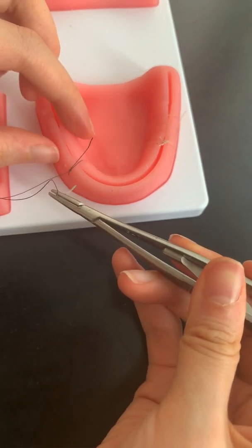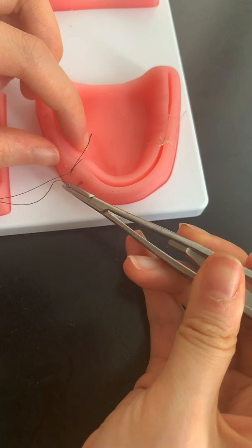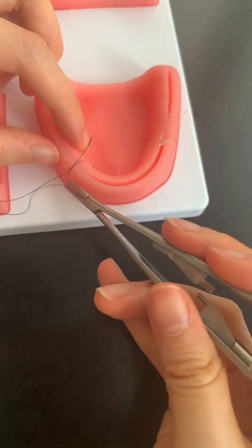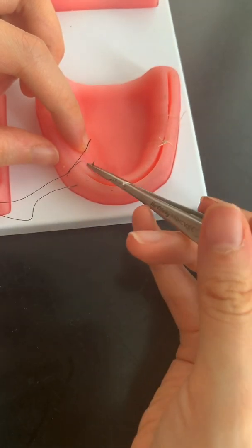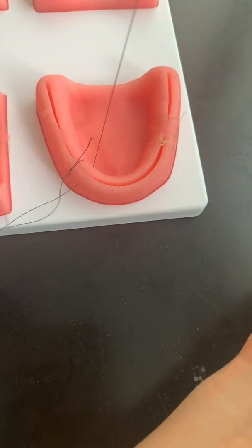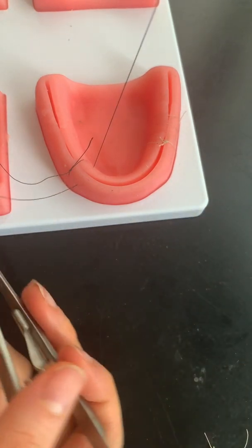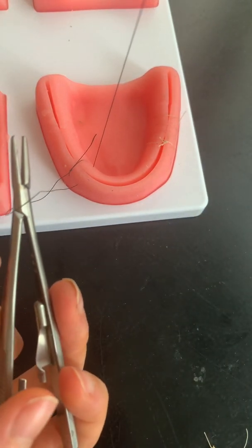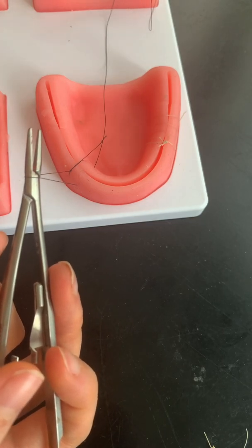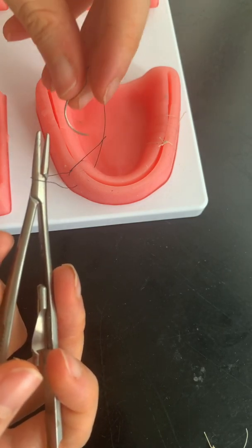So about the same bite depth and you go in. Take a bite just like you would as if you're doing another simple interrupted, and you have this loop right here. What you do is you put this needle through the loop.